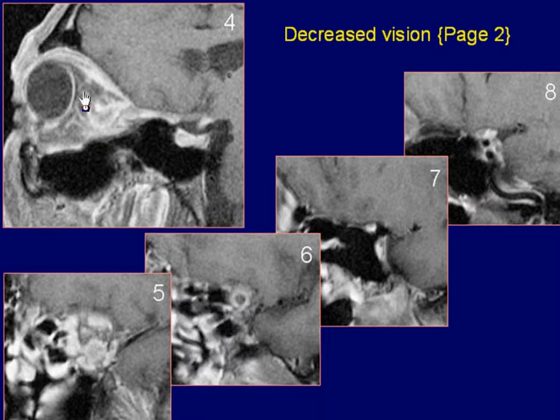Oblique sagittal post-GAD fat saturation T1-weighted image of the left orbit shows peripheral enhancement of the lesion.